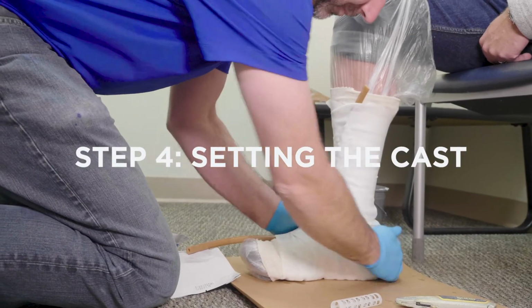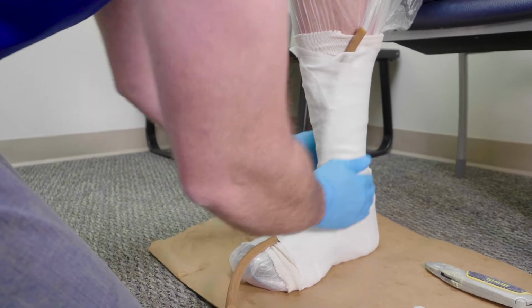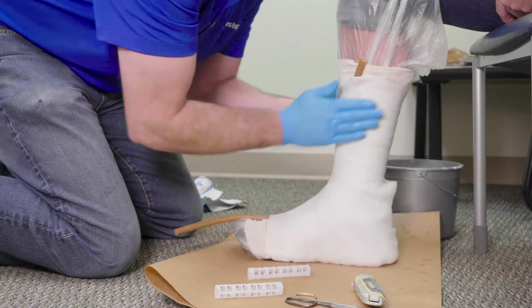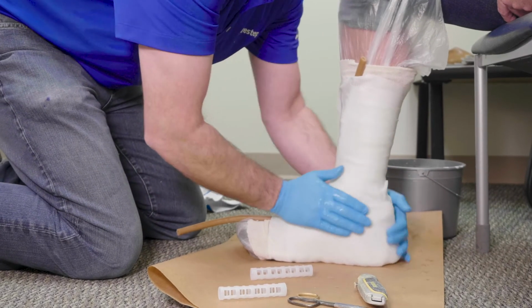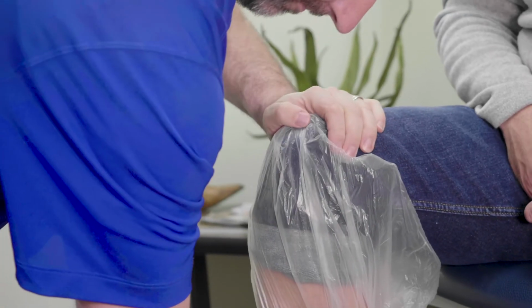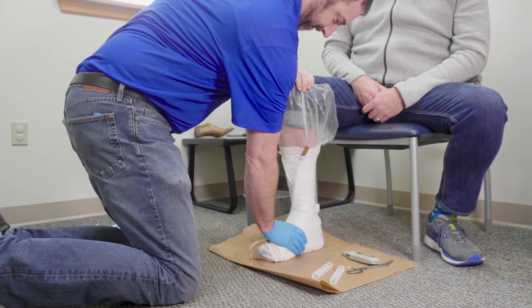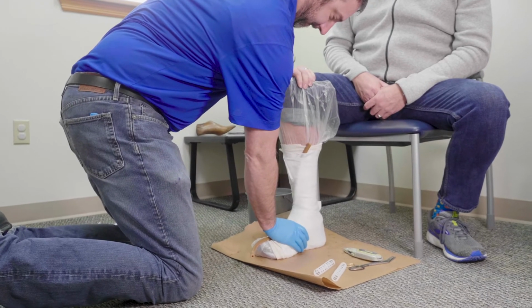With the lower leg wrapped, it's time to allow the cast to set. Return the patient's foot to the ground with the ankle set at a 90-degree angle. In order to recreate weight-bearing conditions, place one hand on top of the patient's knee and push down into the floor, applying a fair amount of force. Keep applying force in this position for 5 minutes or until the cast hardens.